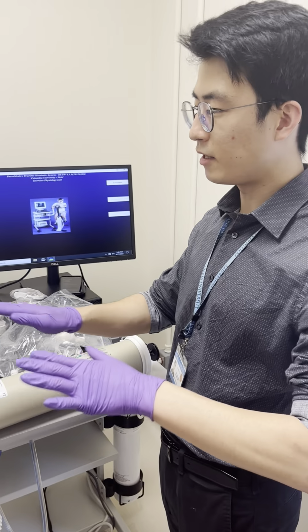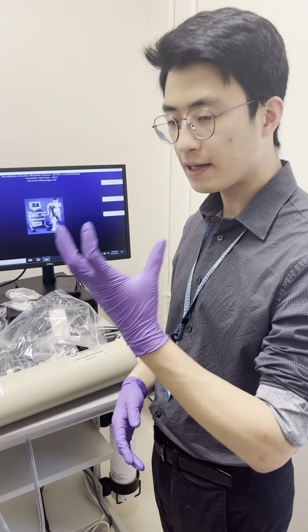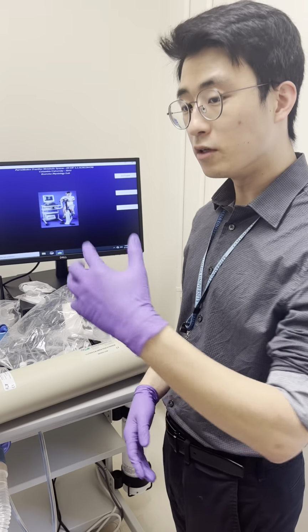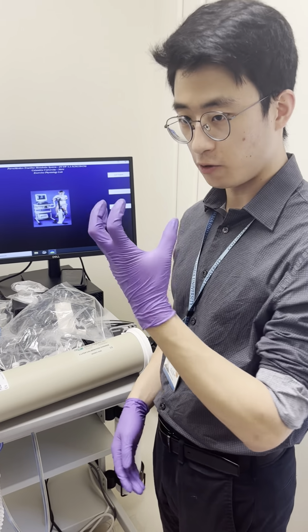So I think it's about 18 to 20 minutes actually. In that time, if you're just breathing through a mouthpiece with a nose clip on, it can really dry your throat. So it might be a really good idea to have the subject drink a little water before you actually start.